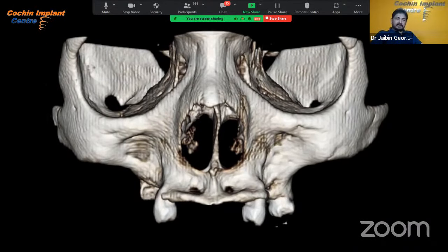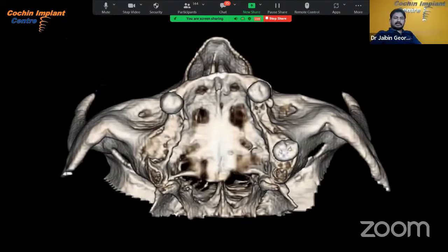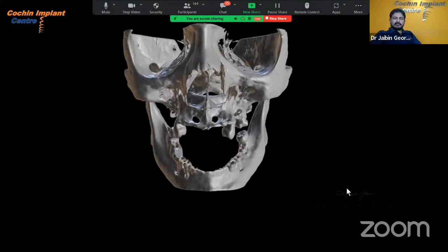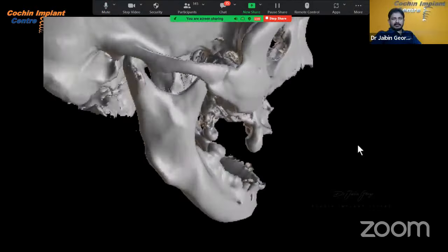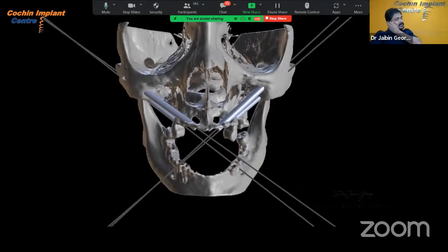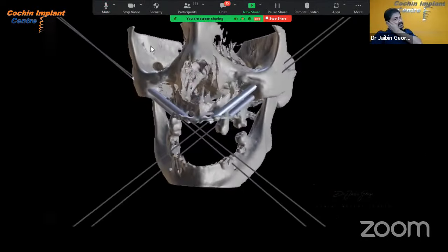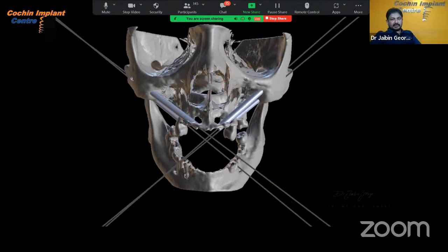This is the 3D rendered image. There was no bone in all the three zones. So this is another view. So every case we do the virtual planning. So this case also, first we do the planning. We virtually place the implants. These are the four zygomas we placed virtually.